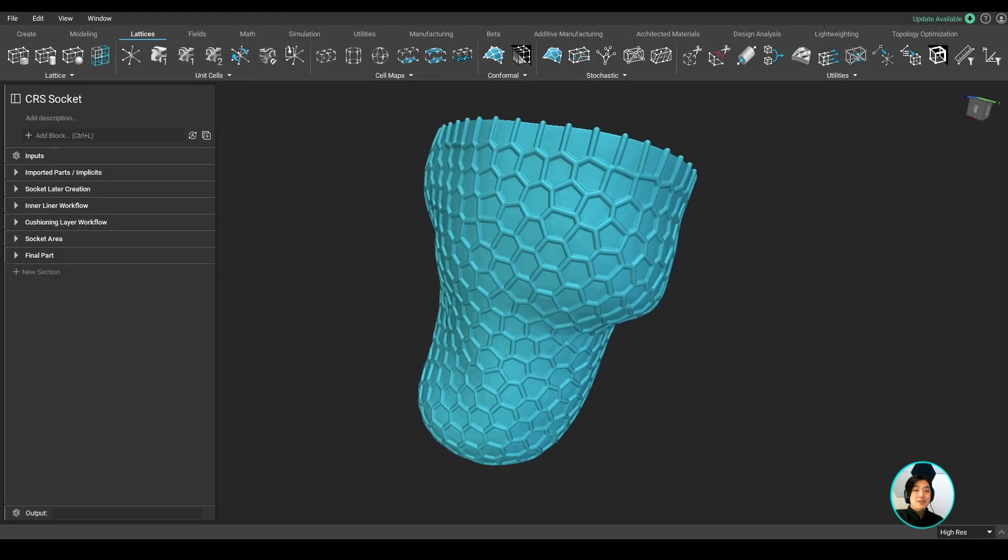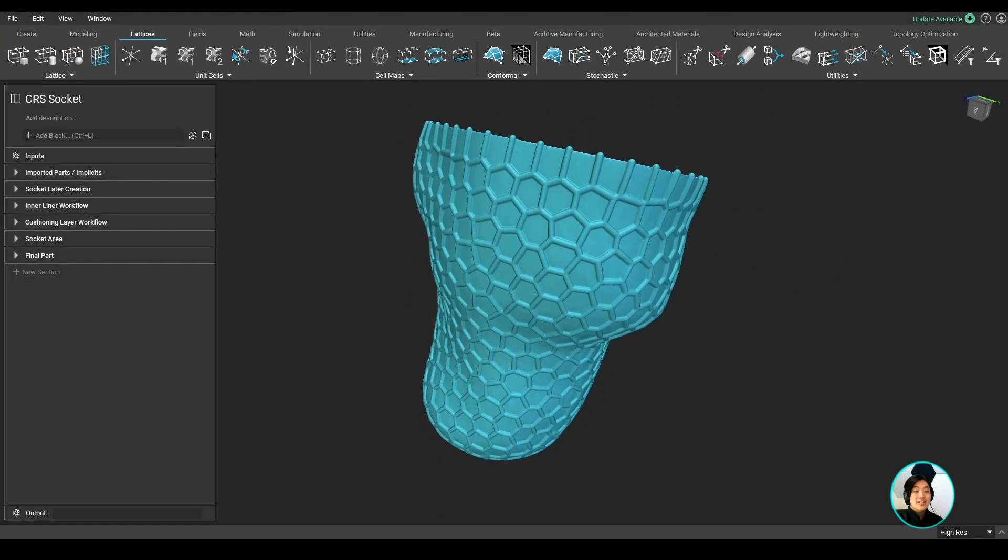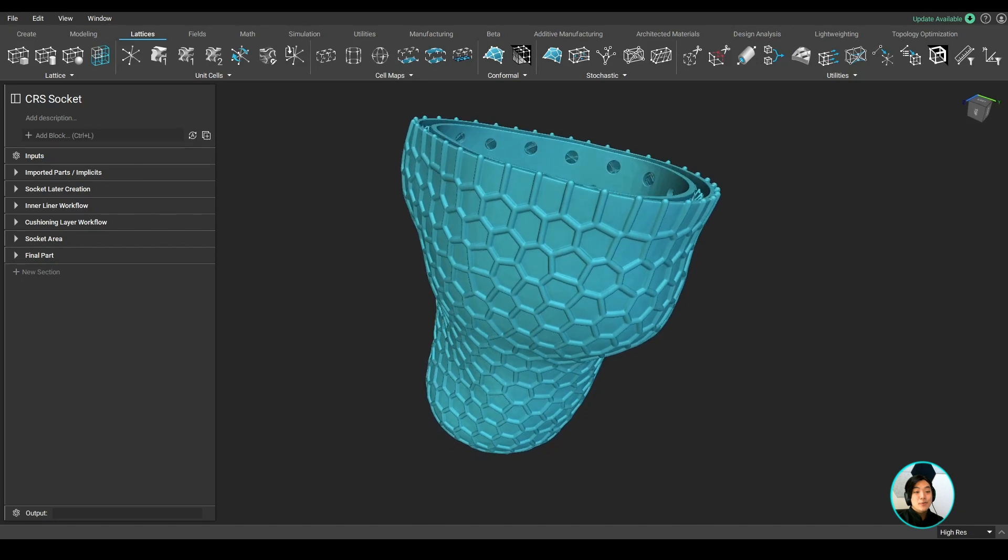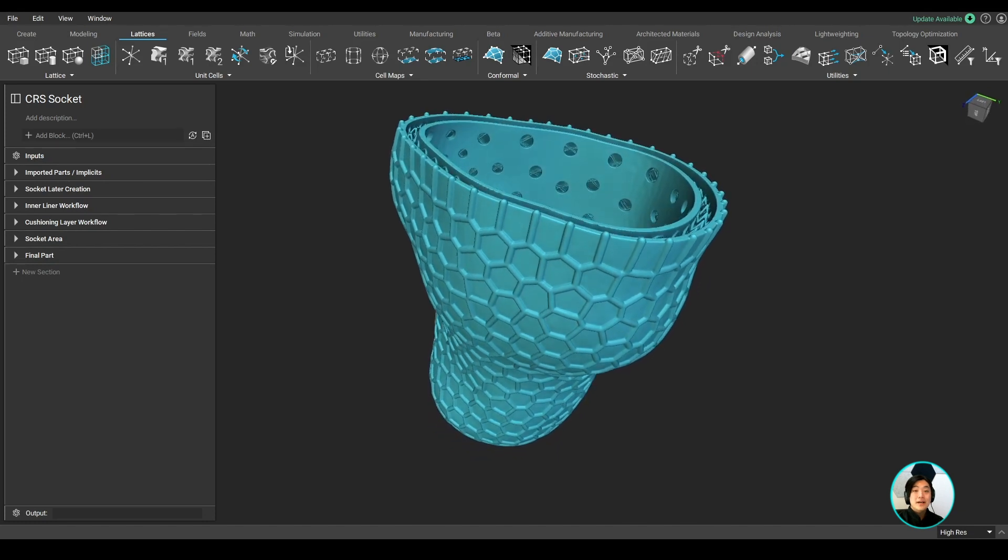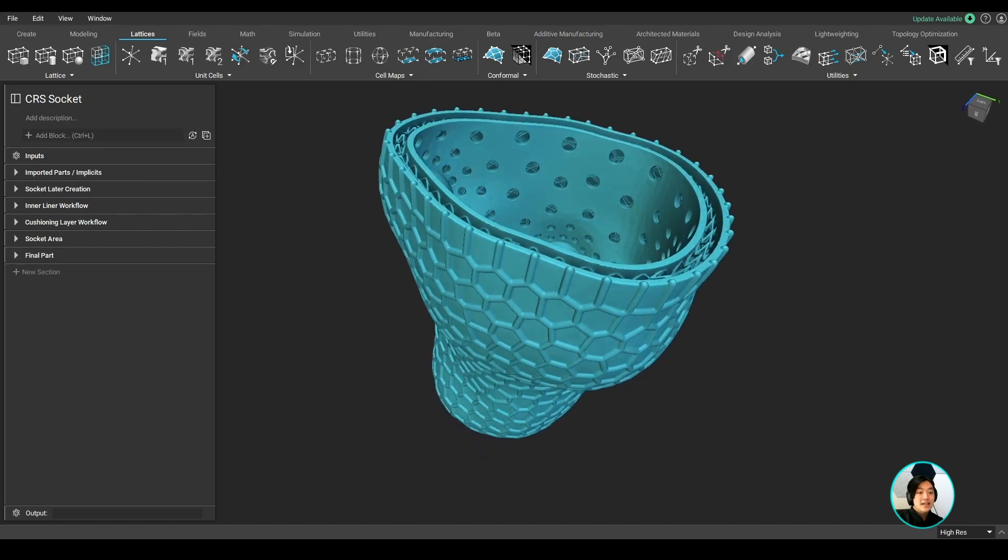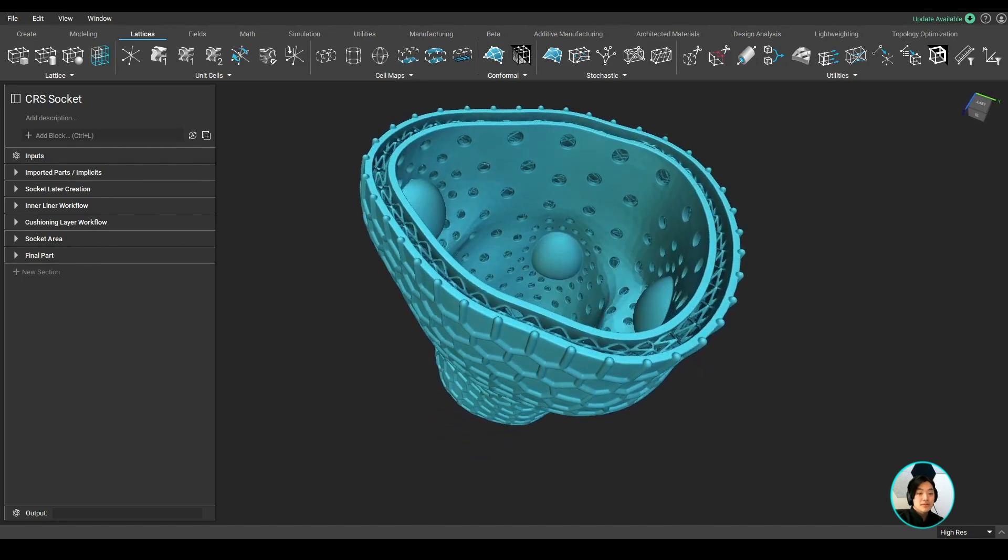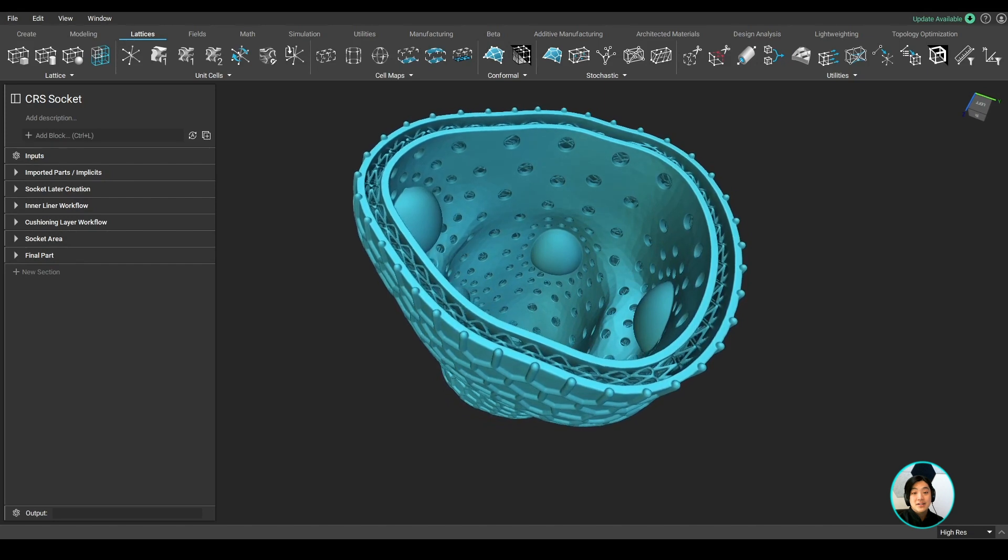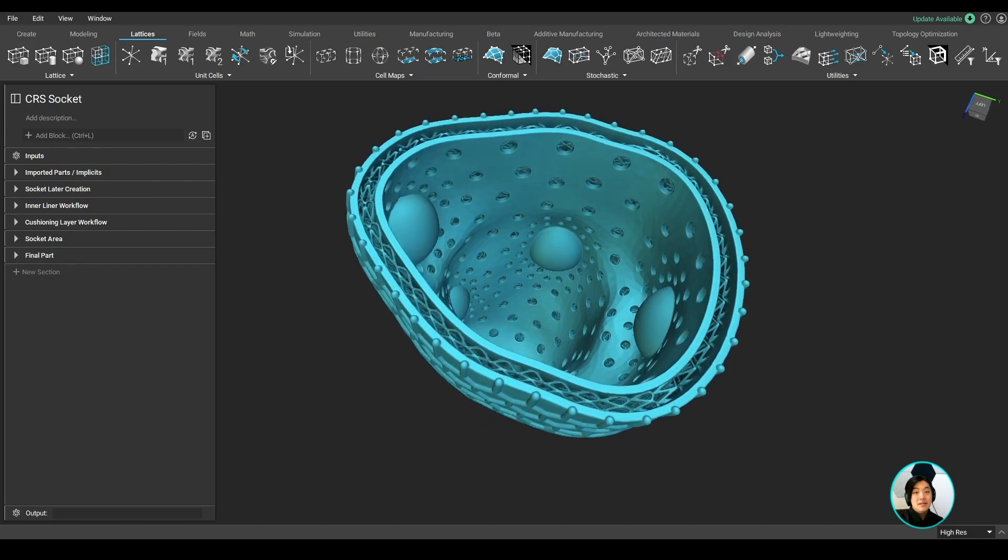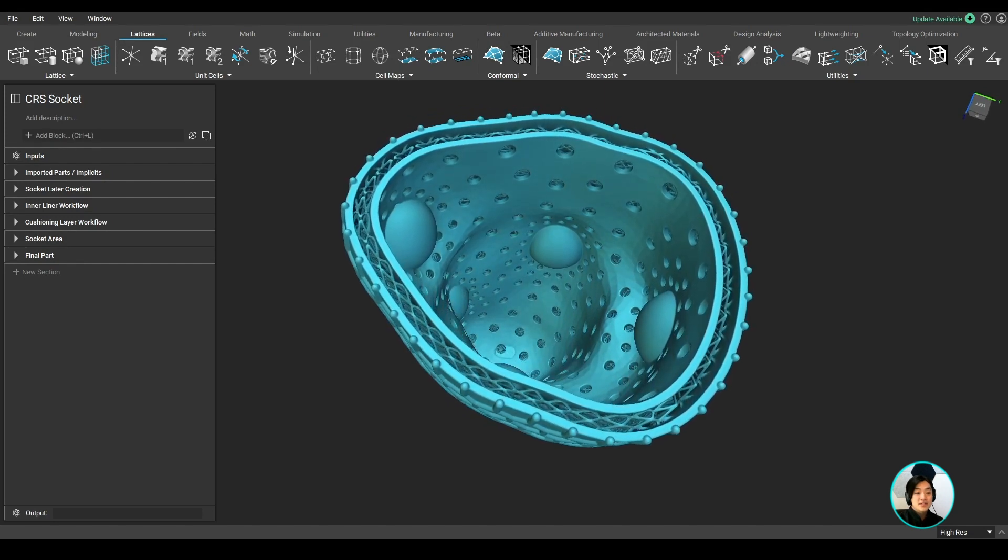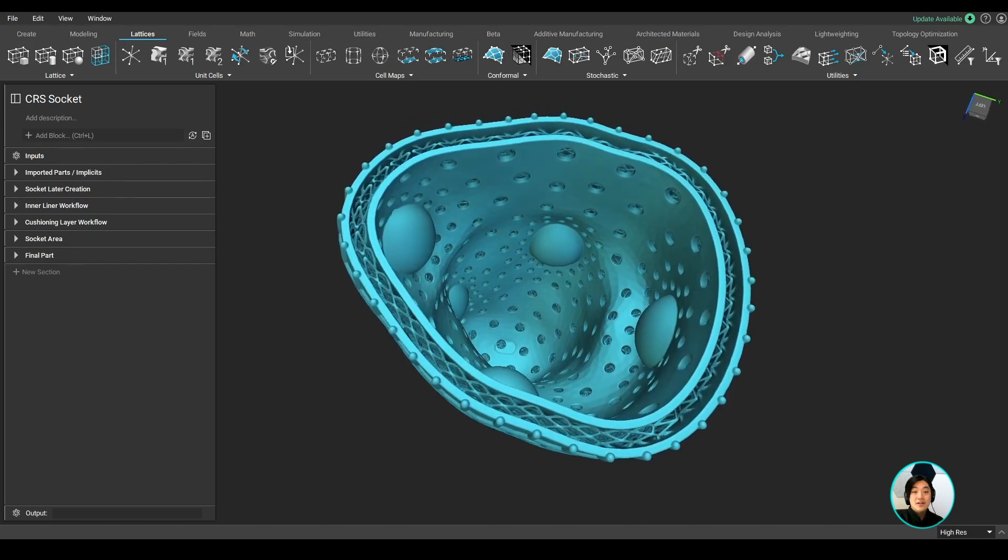Hello everyone, Yuki from nTopology, and today I will show you how to mass customize a highly intricate medical device model like a prosthetic socket to be more patient-specific. Let's dive right in!